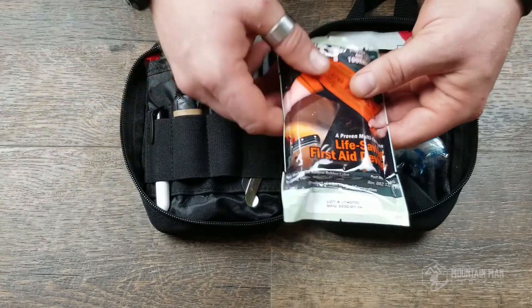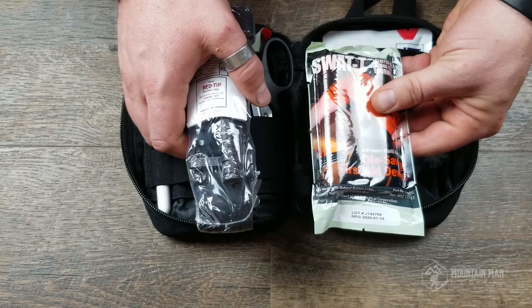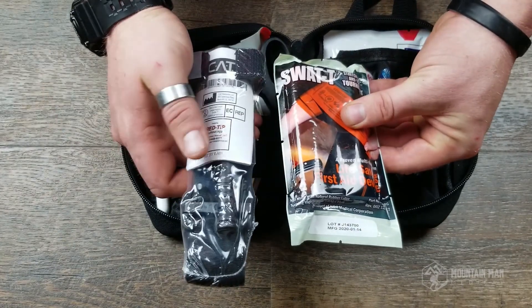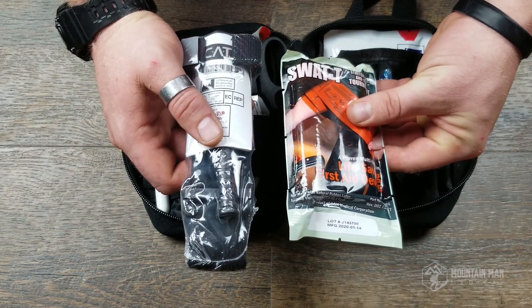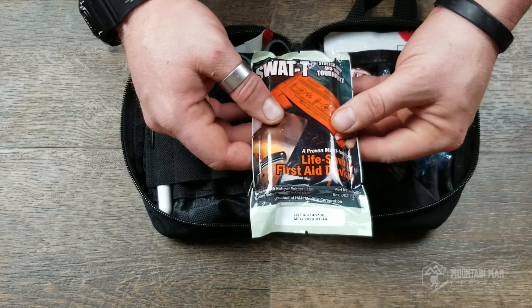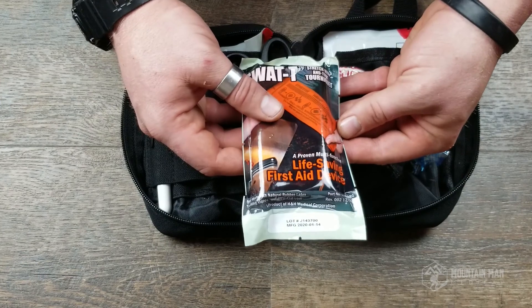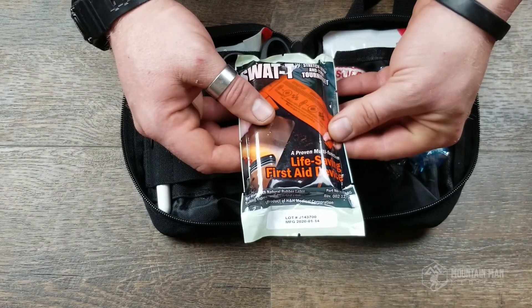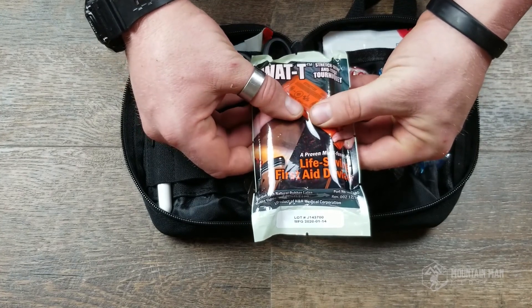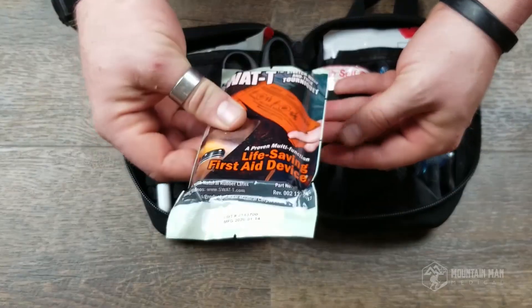We offer the CAT tourniquet as an upgrade on our website so you get both the CAT and the SWAT-T and can keep both in the bag. I recommend keeping the SWAT-T in the bag even if you upgrade, because it fits fine alongside the CAT. More importantly, the SWAT-T is a multi-use item — you can use it as a pressure dressing, a splint, or a sling. Your options are only limited by your creativity. It also increases your ability to treat multiple casualties or multiple wounds on a single casualty.